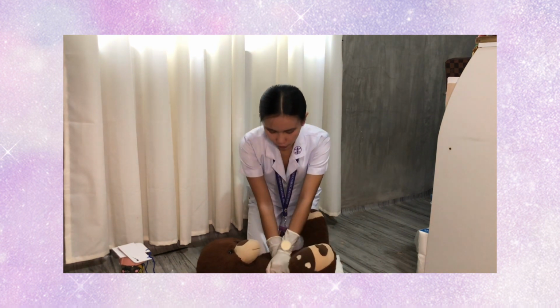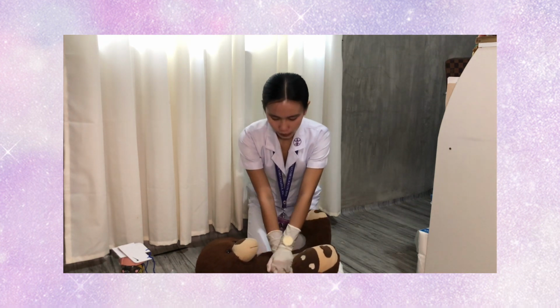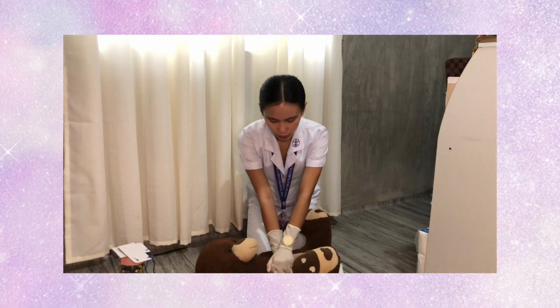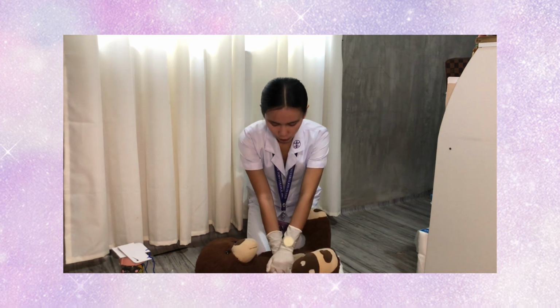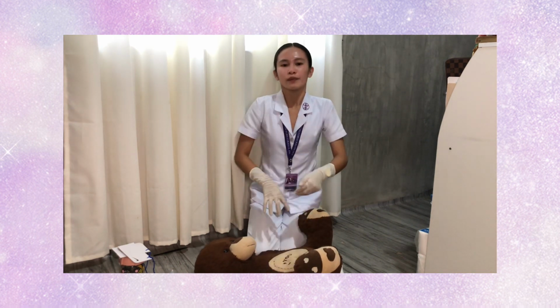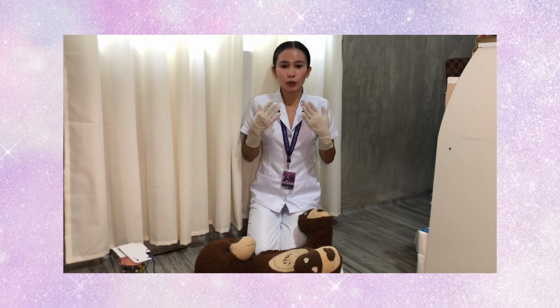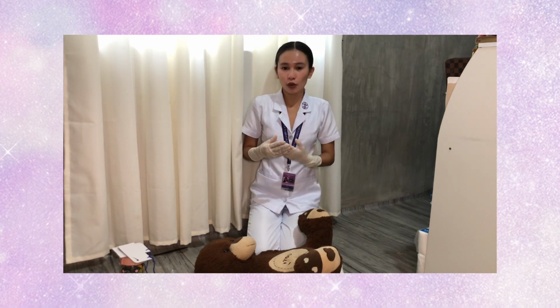1, 2, 3, 4, 5, 6, 7, 8, 9, 10, 11, 12, 13, 14, 15, 16, 17, 18, 19, 20, 21, 22, 23, 24, 25, 26, 27, 28, 29, 30. So now ensure that there is a complete chest recoil for each compression.